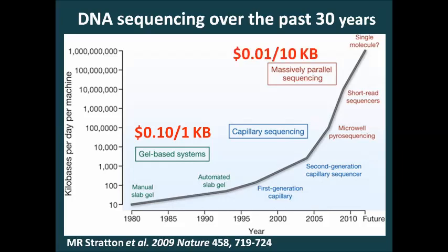As we've increased our technologic capability, we've gone through what was traditionally Sanger sequencing on the far left, which had a slow turnaround time and high cost per nucleotide, to what is now a much cheaper platform that allows many more sequencing reads, thus increased fidelity and high throughput, and thus the capability of screening larger numbers of patients over shorter time periods. Note the steepest point of the curve represented by the past 10 years.